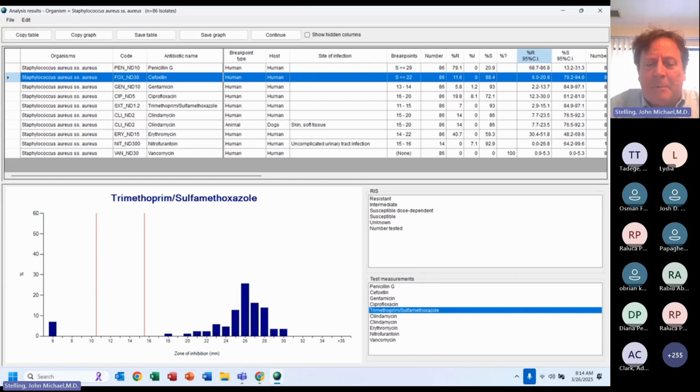So if the bacteria is susceptible to both, you end up with very susceptible. However, if the bacteria is resistant to one of the drugs but susceptible to the other, the bacteria is still susceptible as long as one of the drugs works. So my suspicion is that these bacteria between 23 and 29 are susceptible to both of the drugs, and you end up with synergistic killing.